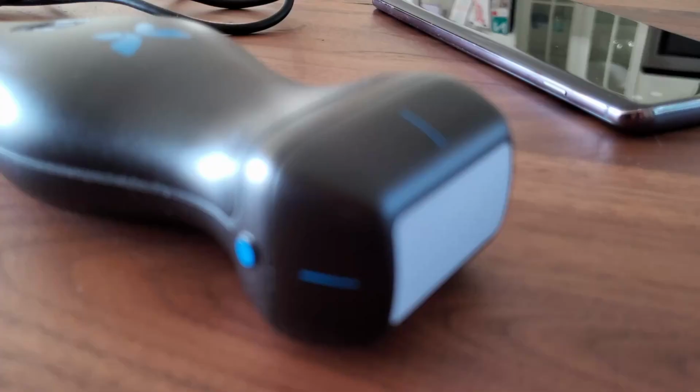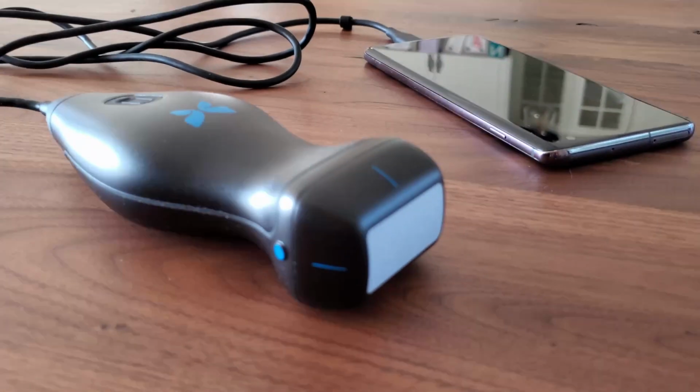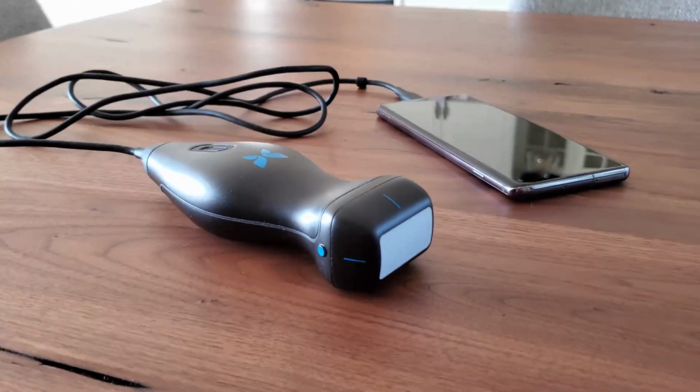So, you just got your hands on a brand new Butterfly iQ Plus, and now you need to know how to save your images. Let's get you up and running. The Butterfly is a handheld device that our family medicine residents will be using. You just download an app and it plugs into your phone or a tablet.